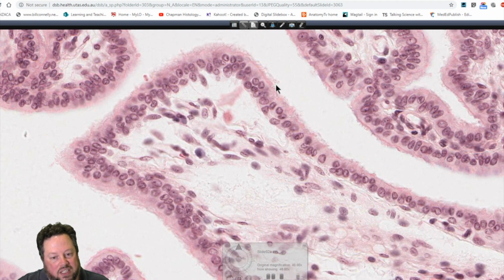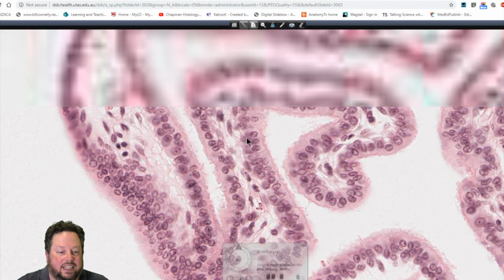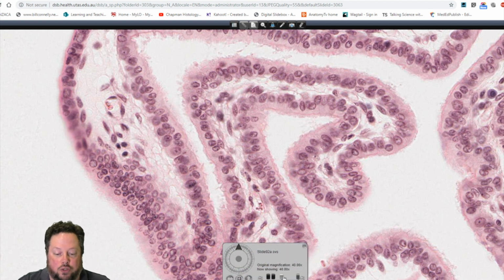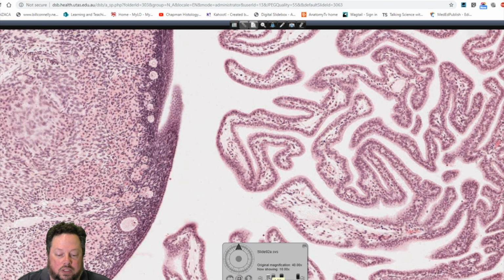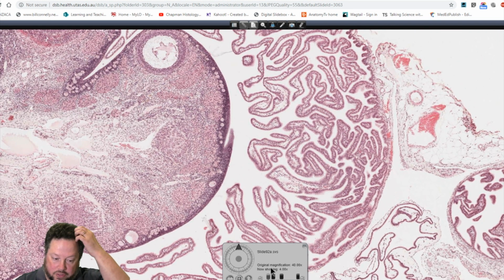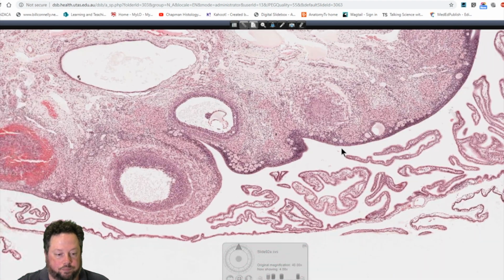we can actually see some cilia on the surface. So these are highly ciliated areas. They create a current to draw the oocyte from the pelvic cavity inside the uterine tube for transport down the uterine tube, hopefully for fertilization if that's what the person who's ovulated wants.